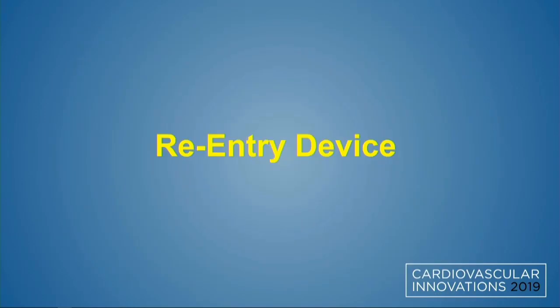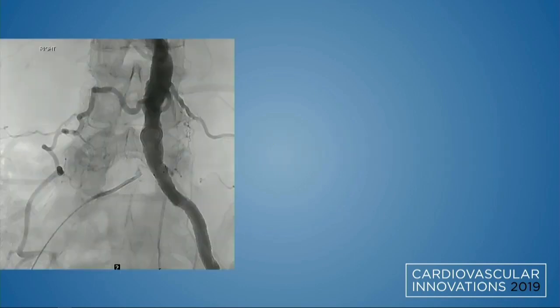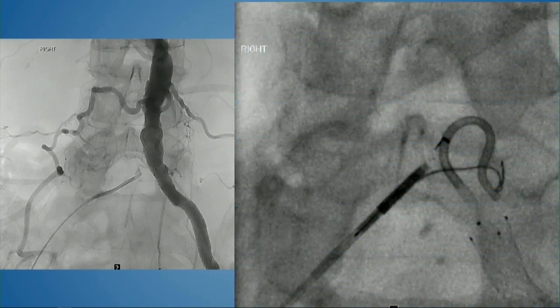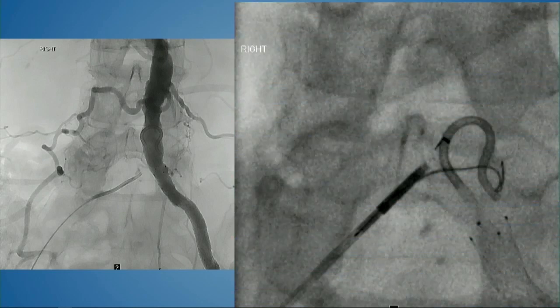So in those situations when you can't go antegrade or retrograde, as in this 69-year-old who had a lot of comorbidities, claudication that's getting worse, you have this picture. And I think most of you can assume that catheter on the right there is an angled catheter and a Terumo glide wire, which was not staying luminal. So at that point, I like to put the Outback in there. It's a 6 French. It's nice because it's a 014 wire that you puncture across with.